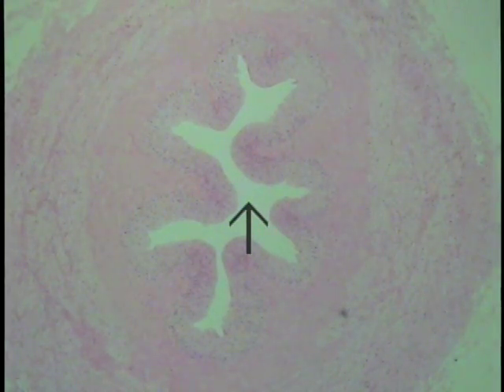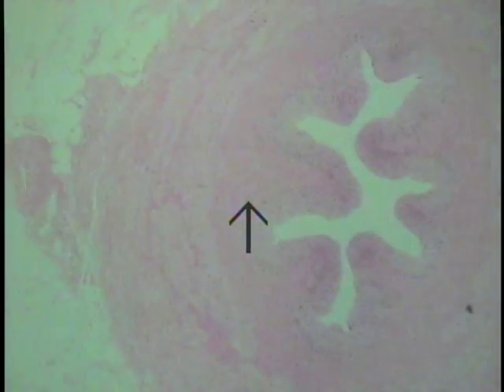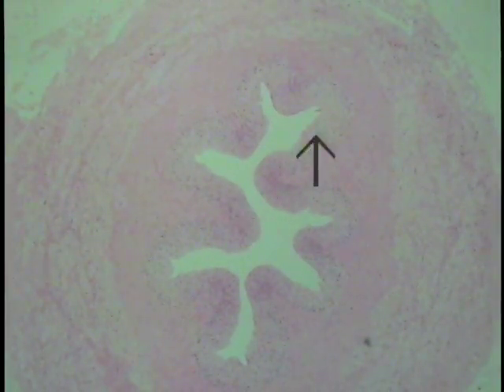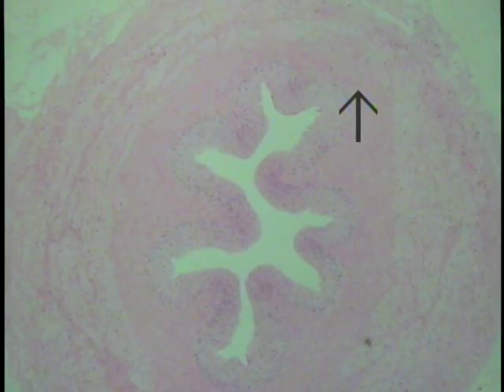Another form of the stratified epithelia is transitional epithelium. This type of epithelium is restricted in distribution to the urinary system. The section in the field is through a ureter, that small tube that conducts urine from the kidney to the urinary bladder. Examine its luminal surface or interior for this typical transitional epithelium. This field represents a section typically of transitional epithelium in the non-distended condition.